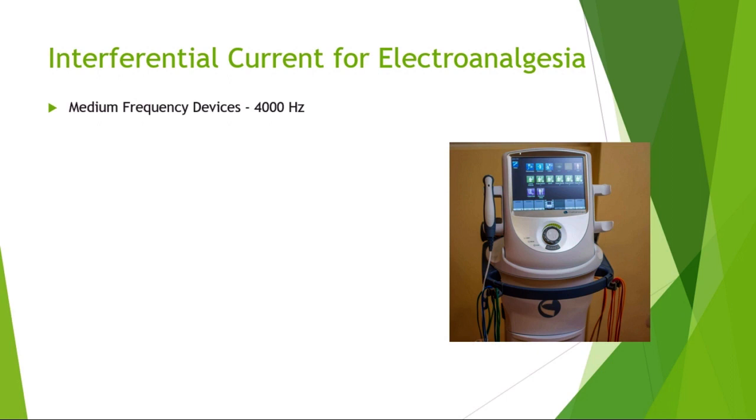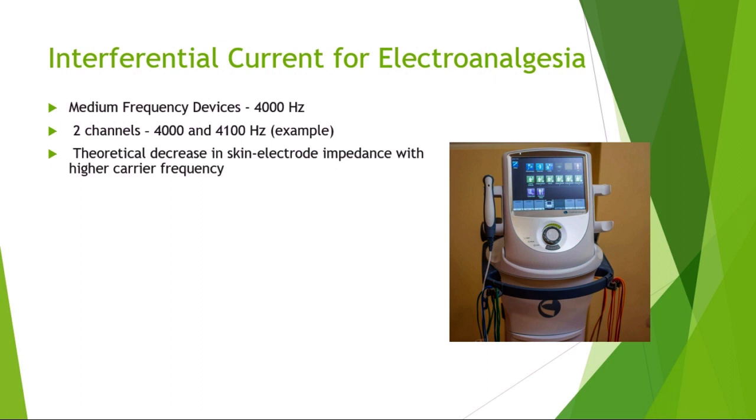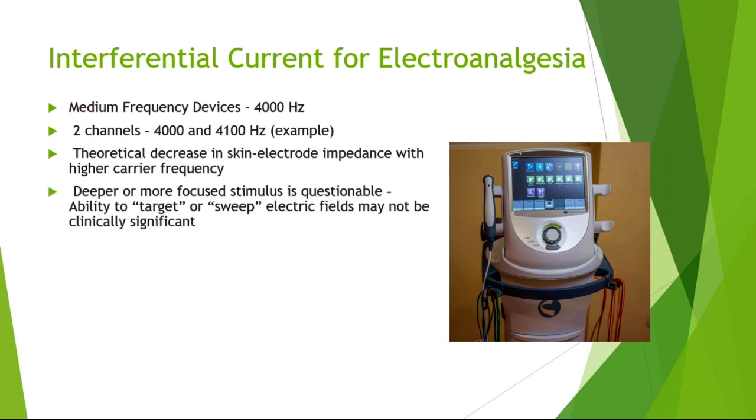Interferential current. Medium frequency devices, 2 channels that interfere with each other. There's a theoretical decrease in skin electrode impedance with a higher carrier frequency. We're not adjusting the carrier frequency a lot, but that's one of the ideas as to why IFC is desirable.